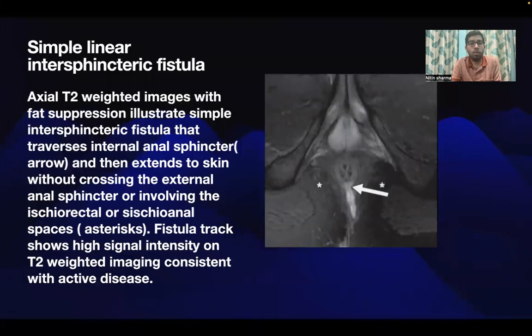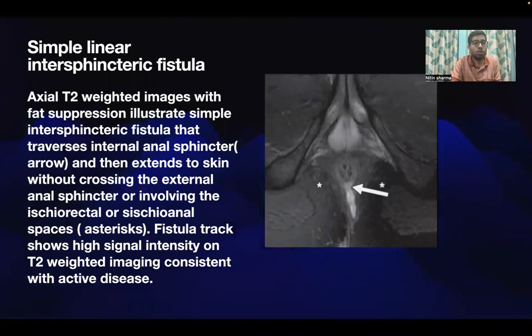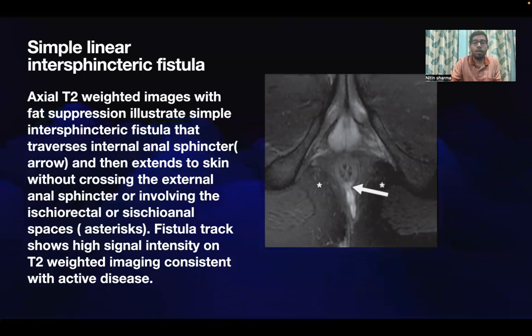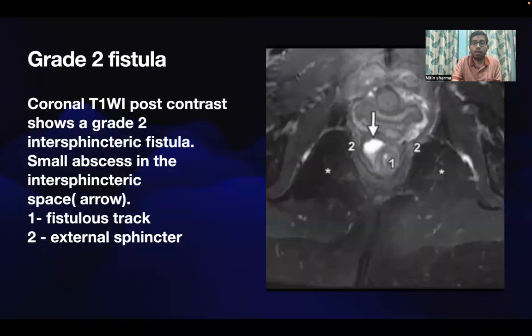This axial T2-weighted image with fat suppression illustrates a simple intersphincteric fistula that traverses the internal anal sphincter and extends to the skin without crossing the external anal sphincter or involving the ischiorectal or ischionanal space. The fistula track shows high signal intensity on T2-weighted imaging, consistent with active disease. This is a grade 2 fistula.